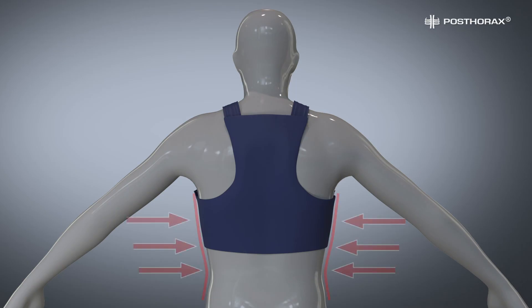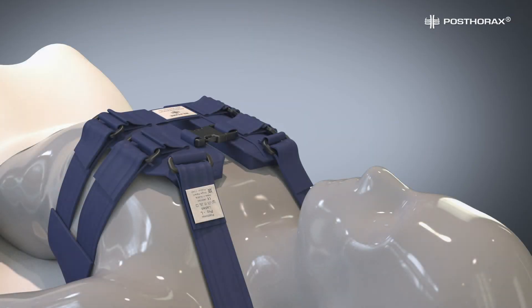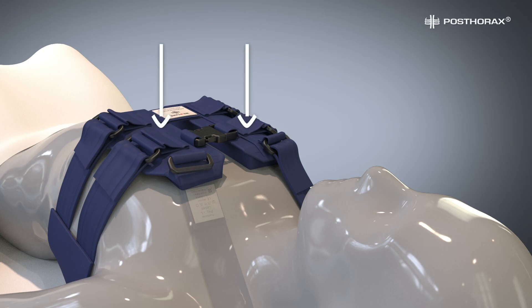The vest should have a snug fit around the body. It is very important that the back part of the vest sits below the shoulder blades at all times. With a properly fitted vest, the cushions should always sit flat on the chest, exerting a light frontal pressure onto the chest. Reassure the patient that this pressure is normal and needed for stabilization of the sternum bone.